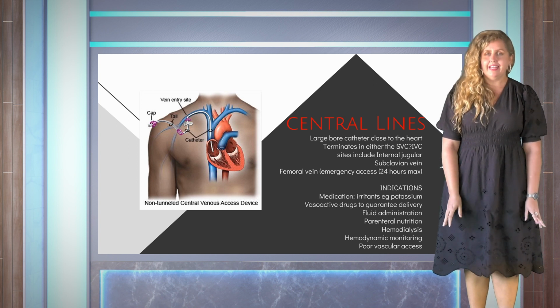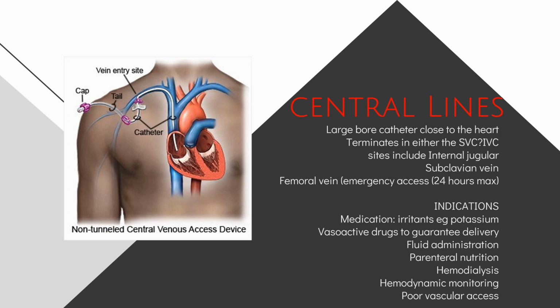So what are they exactly? They're large bore catheters close to the heart. They terminate in either the SVC, superior vena cava, or the IVC, inferior vena cava, depending on where they were inserted. And what are those insertion sites?